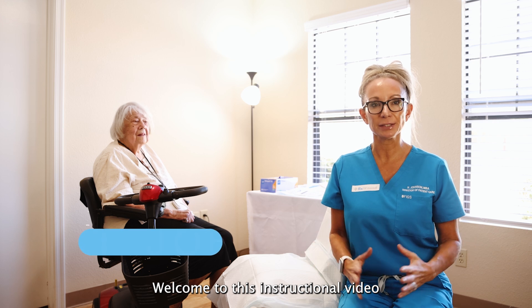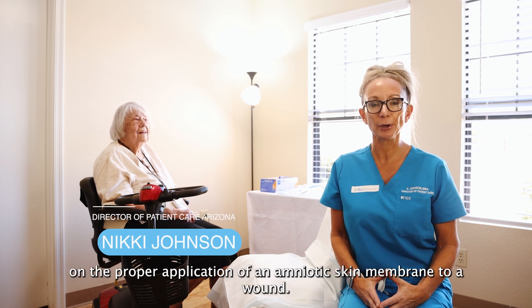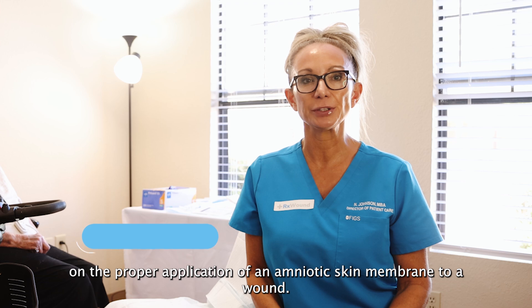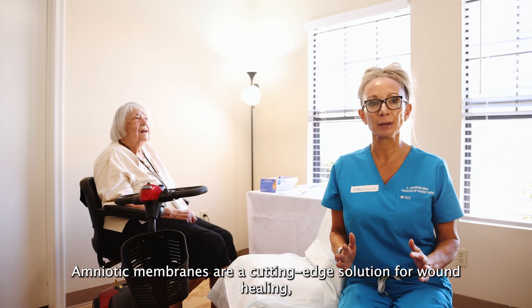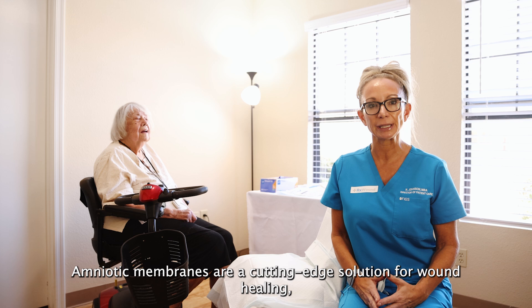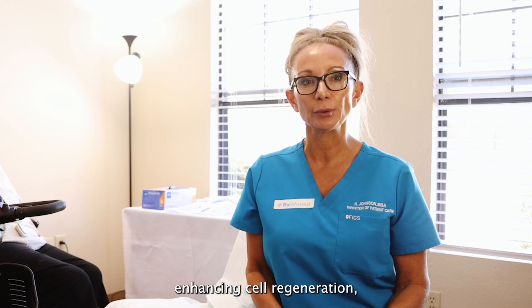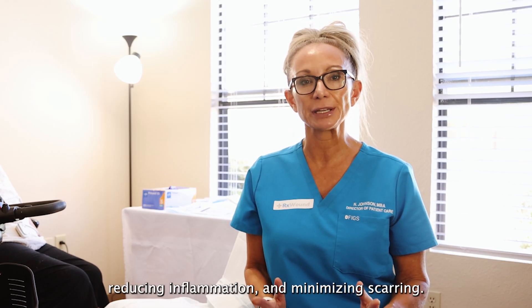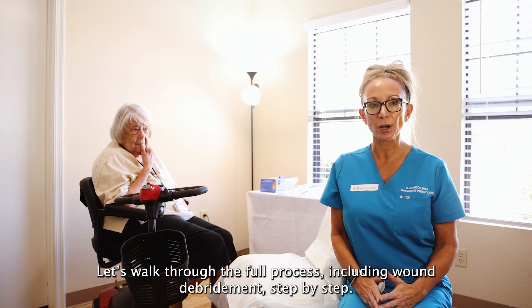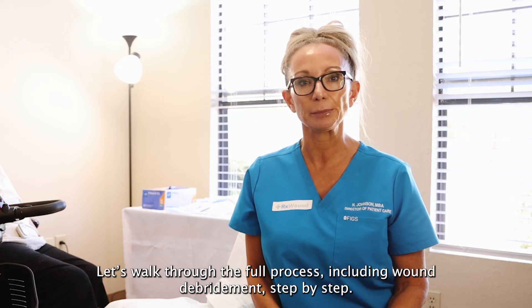Welcome to this instructional video on the proper application of an amniotic skin membrane to a wound. Amniotic membranes are a cutting-edge solution for wound healing, enhancing cell regeneration, reducing inflammation, and minimizing scarring. Let's walk through the full process step by step.